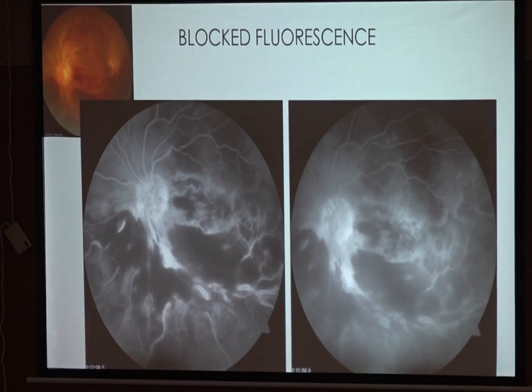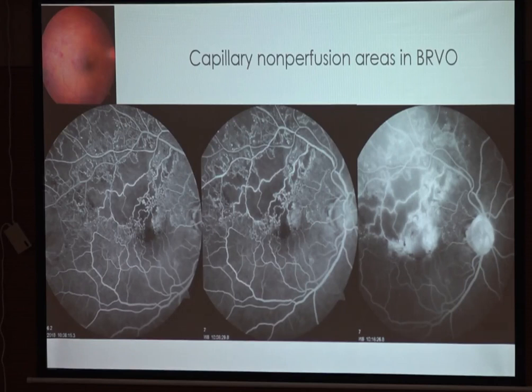Right. And if you look at this, again you are seeing an area of hypofluorescence with pinpoint hyperfluorescent areas also, right? This is hypo, which is decreasing in late phase. If you look at this and you look at this, the amount of hypofluorescence has decreased. So this is capillary non-perfusion, and at the same time you are having areas of hyperfluorescence. So surrounding this microaneurysm, there is edema and it is leaking. So this is branched retinal vein occlusion.